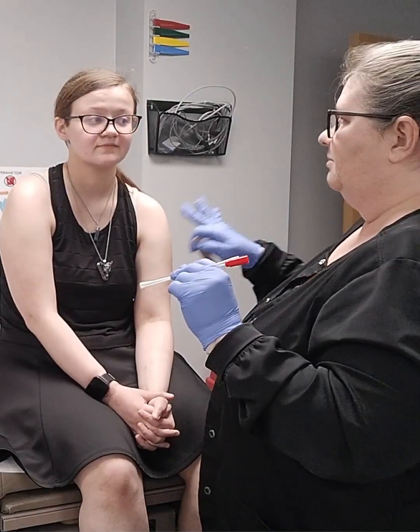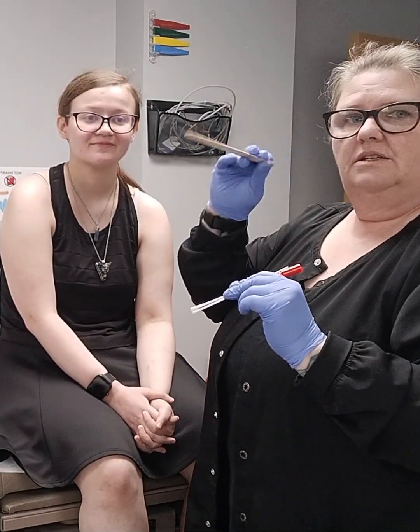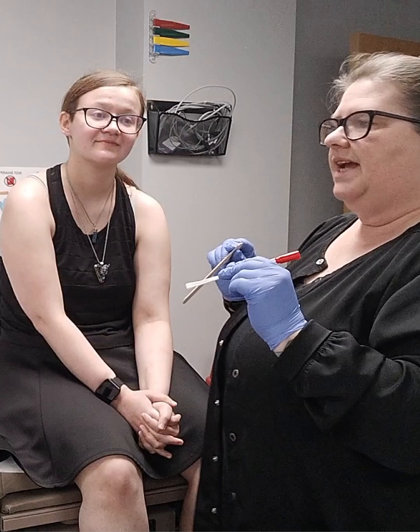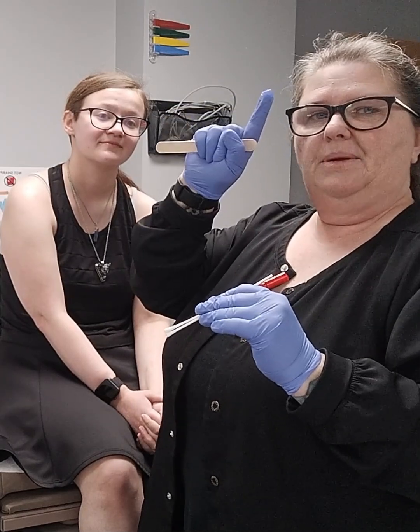I'm going to go ahead and ask her in a moment to open her mouth, stick her tongue out, and I'm going to put this tongue depressor on her tongue, and I'm going to ask her to say 'ah.' The reason we have our patients say 'ah' is because when you do that, your uvula in the back of your throat raises up.